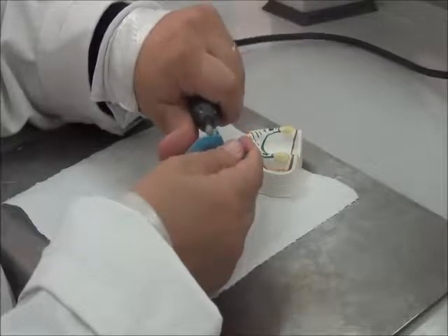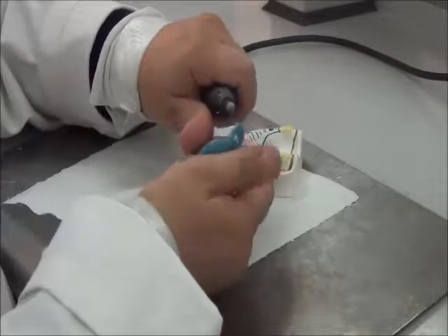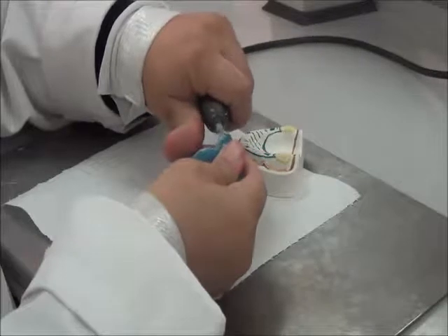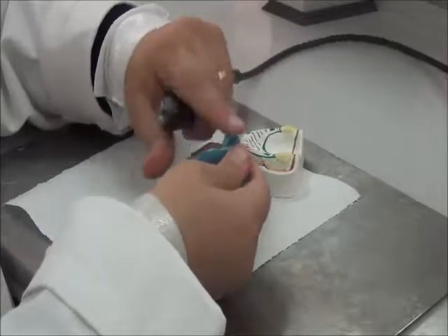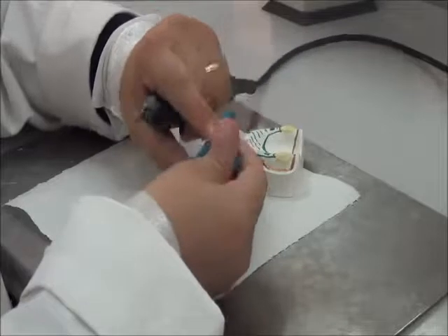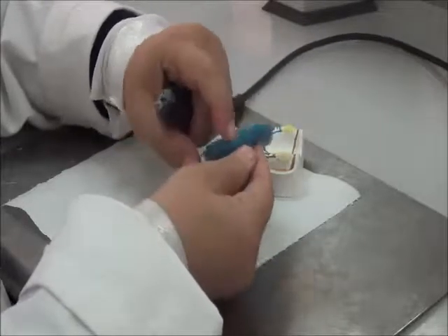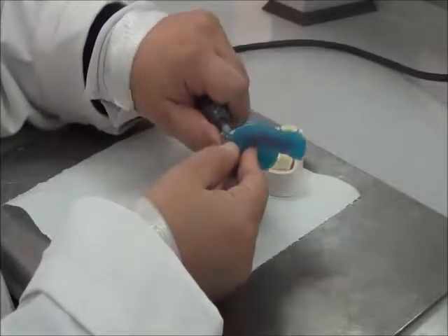You can see my finger rest at all times. I'm holding the tray firmly. I'm just running over the border to remove sharp areas, and you can notice from the light color produced that these are now smooth. So it becomes an area rather than a sharp edge.